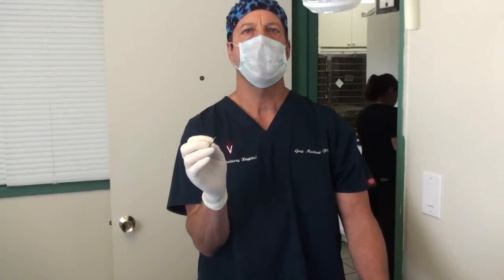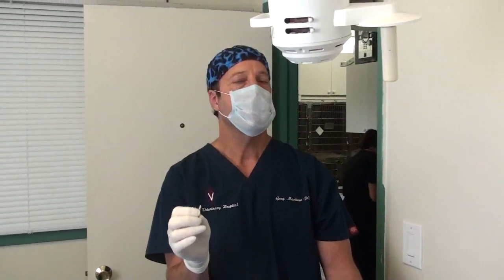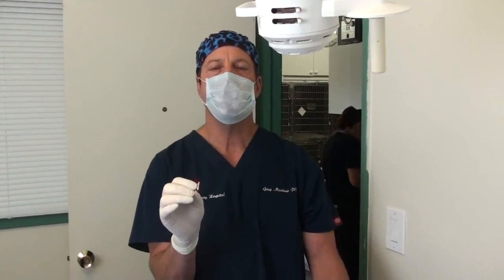I usually don't want to operate on these because dogs tend to beat them up again and again. This one has a kind of growth on it, it looks ugly, and it's never going to heal as is, so I'm going to be brave and cut it out. The easy part is cutting it out — the hard part is whether the dog will let it heal. I'm also going to look at the tissue to make sure the callus didn't turn into a tumor.